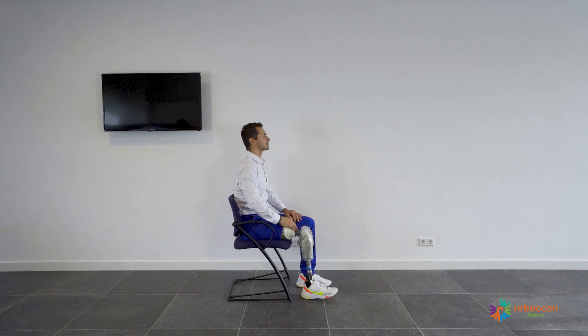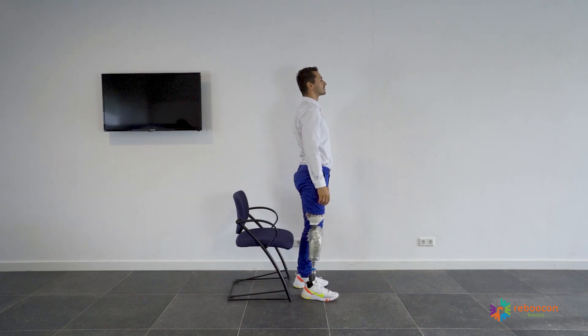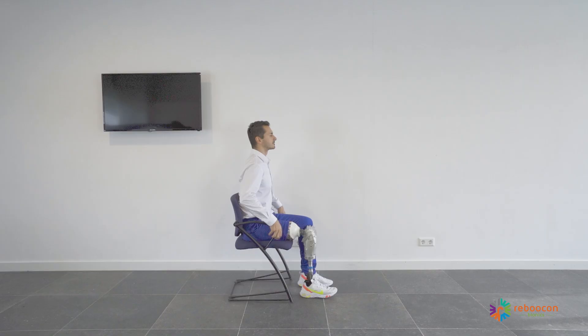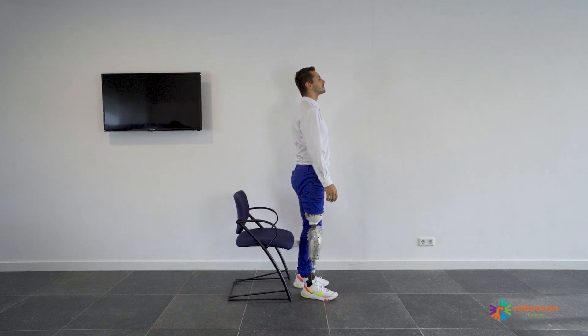To stand up: load the prosthesis, distribute the weight evenly, lean forward, and stand up in one fluid motion. Use the armrest to get extra support, if available.